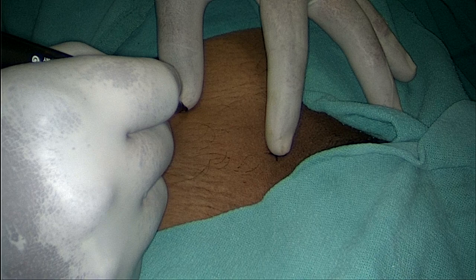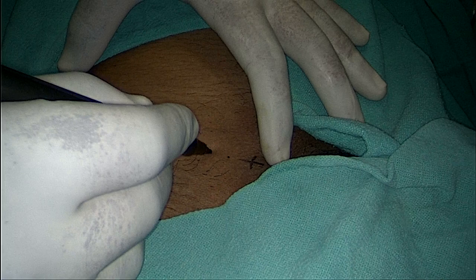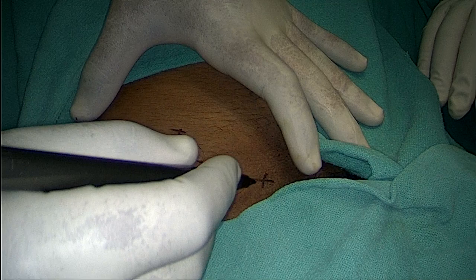Hello everyone, this is the case of right inguinal hernia. My first cross is on the superficial ring and the second one is on the deep inguinal ring. The dotted line you are seeing connects the ASIS to the pubic tubercle, and the deep ring is 1.25 centimeters above the midpoint of the ASIS and pubic tubercle.